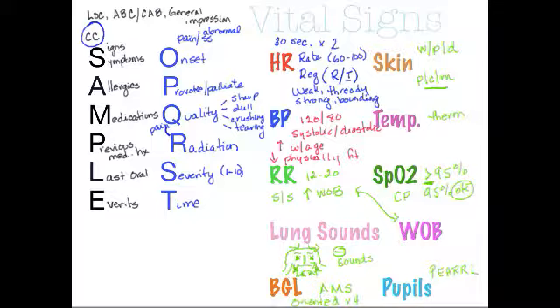What you're going to do is put that blood pressure cuff on your patient and read the cuff, because it'll say this side to patient, and that ensures you have it facing the right way so that when you blow it up, the Velcro will actually stick. If we know that a systolic of 120 is pretty common, we can pump it up to about 140 to 160 for an adult. For elderly people, we might want to go a little higher in case they have a history of hypertension.